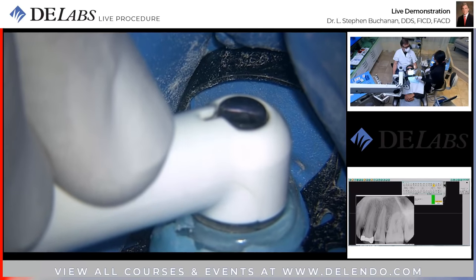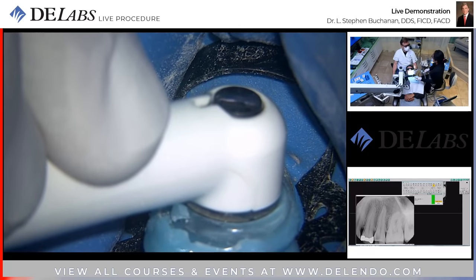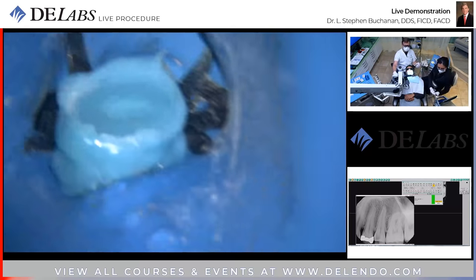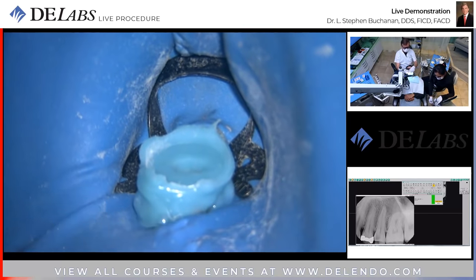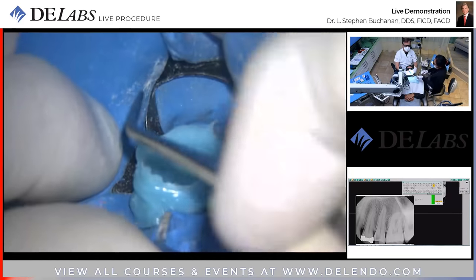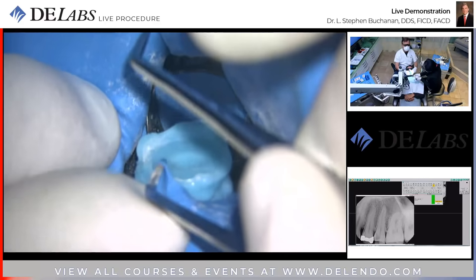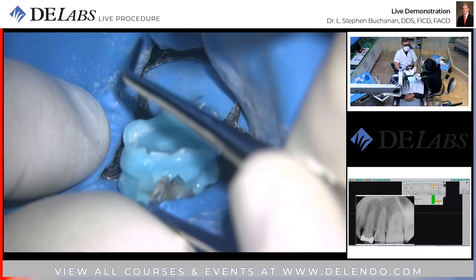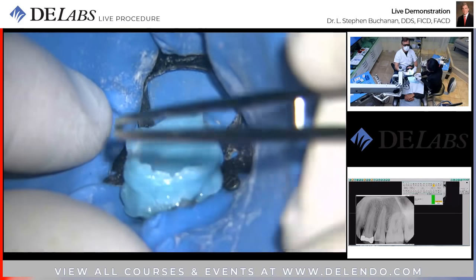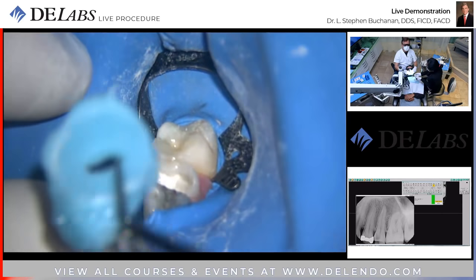What time is it now? 2:40. 2:40? Did we start right at 2? Yeah, okay. So we're 40 minutes into this case. And we just accessed, got rid of the decay, negotiated the canal, did a light gauging routine. There we go.